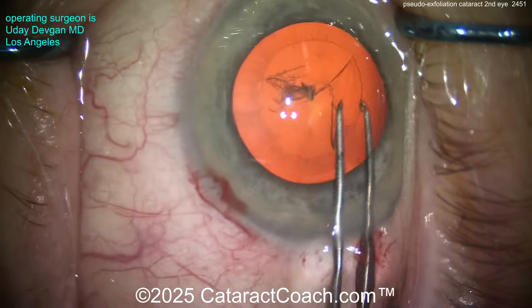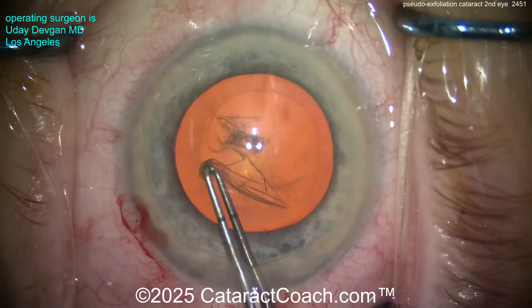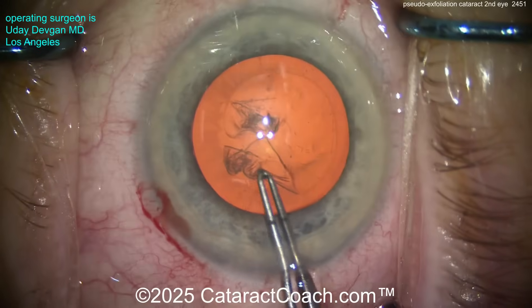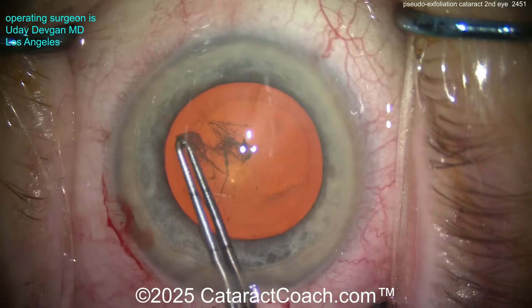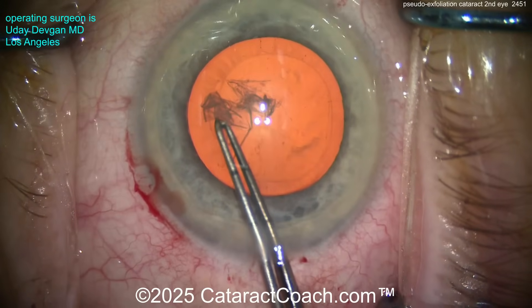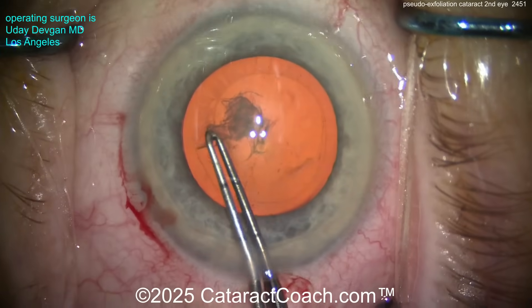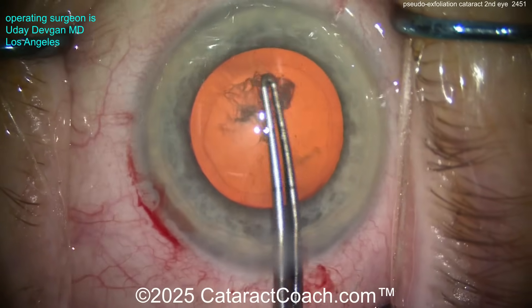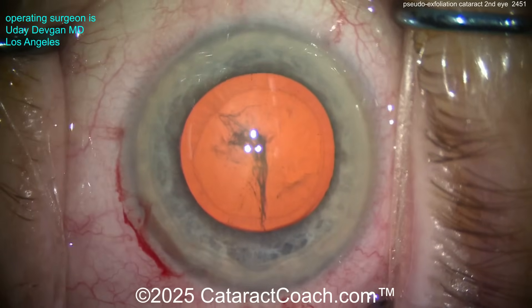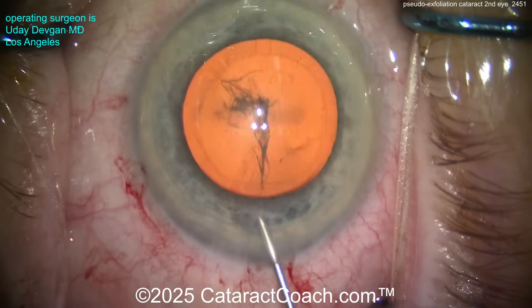We're trying to create a good-size rhexis. Look how slow I'm going — just taking my time. I want this to be overlapping the optic 360 degrees, and I want it to be basically five and a half millimeters. I'm measuring again with the forceps just to be sure. You may ask: why are you going clockwise? Don't you normally go counterclockwise when you create a rhexis? And my answer is, does it really matter? No. There's your capsule rhexis — looks pretty good, just about five to five and a half millimeters.